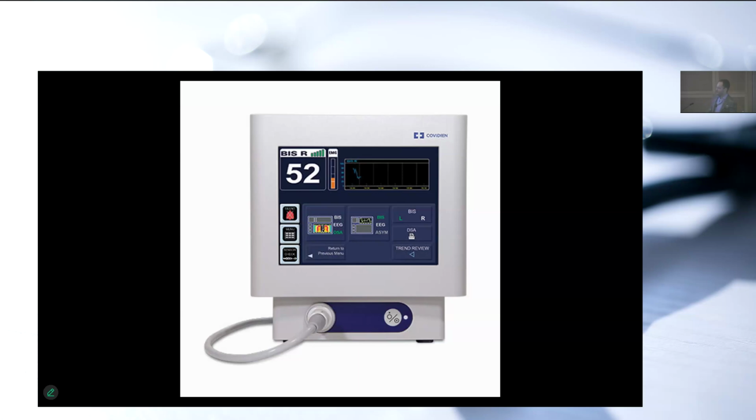It was sold everywhere for the reason that people wanted a way to prevent awareness. Why? Because there was a rise in the notion of patient safety in the late 90s and early 2000s. And this felt like a way that we could prevent a really terrible complication of anesthesia. So EEG had its revival with this device for the specific reason of preventing awareness.